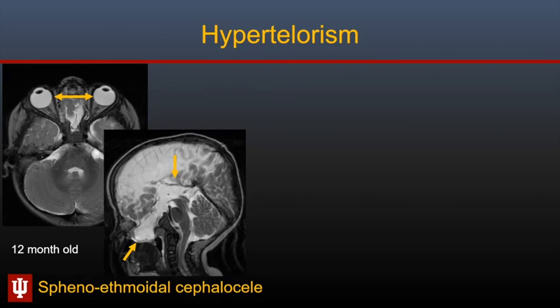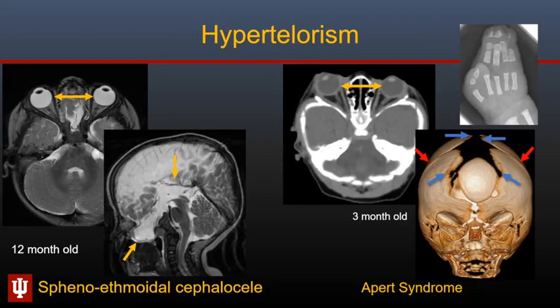Here is a 12-month-old with hypertelorism who has a sphenoethmoid cephalocele and agenesis of the corpus callosum. This is a 3-month-old with Apert syndrome who has hypertelorism along with brachycephaly — anteroposterior flattening of the calvarium. There is synostosis of the coronal sutures and widening of the metopic and sagittal sutures. Children with Apert syndrome characteristically have syndactyly — fusion of the digits — as seen on the hand x-ray.